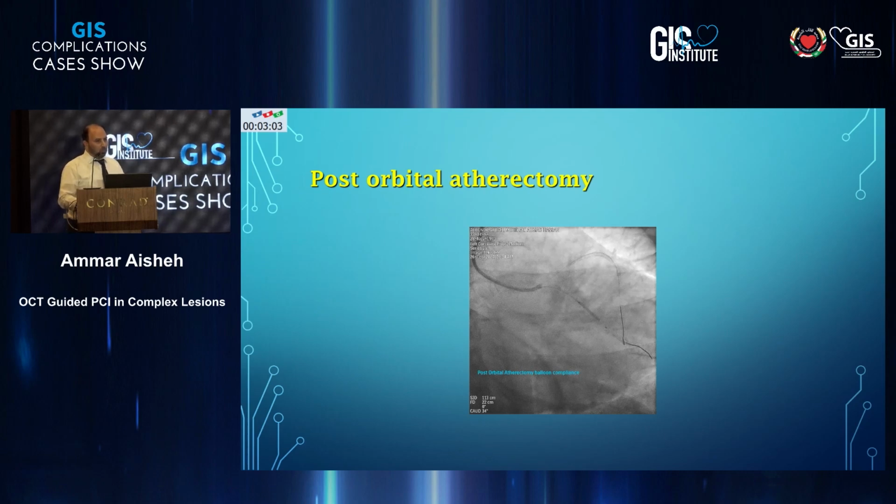So this will be a great case to do OCT after you have done CSI and see how much calcium you have, and whether it is fractured or not. There are good studies from South Korea about the amount of calcium and how good a stent expansion you would get. So there's that score of 4. We can leave the discussion after the case, please.